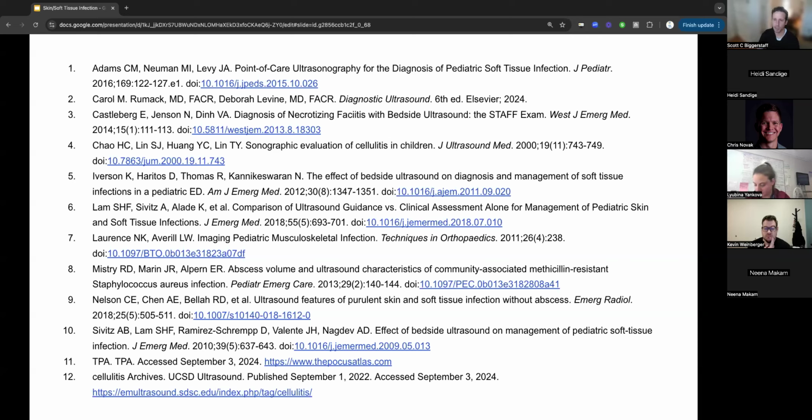You're generally not using sterile ultrasound gel, so I'm definitely not putting ultrasound gel on an open incision or something that's still healing. Yeah, I think I'm more thinking of kids who come back 2 weeks later. Yeah, I was just curious.